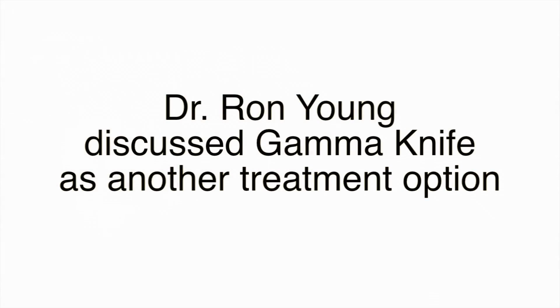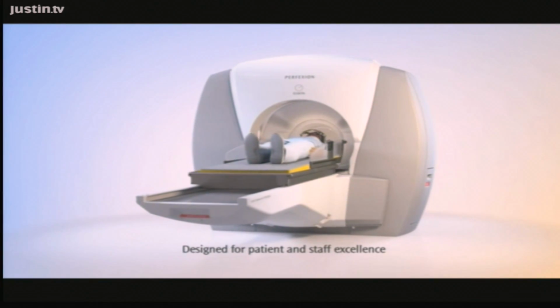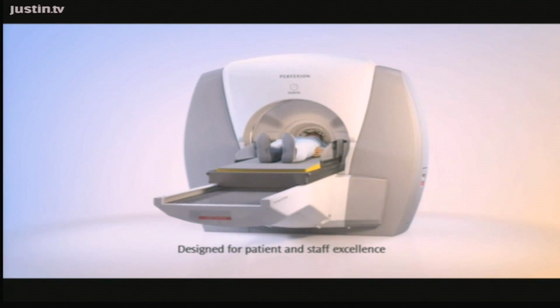Yeah, that's fantastic. Next, I'd like to introduce Dr. Ronald Young, and he is one of the 3 neurosurgeons here at Swedish Neuroscience Institute performing deep brain stimulation surgery. Beginning in around the late 1980s and especially early 1990s, we began to use this device called the Gamma Knife. It's called Gamma because it uses gamma rays. What we do in the Gamma Knife is form these gamma rays generated by radioactive cobalt into very narrow beams. And I think the Gamma Knife results are relatively similar. Around 70 to 80% get a really good benefit.